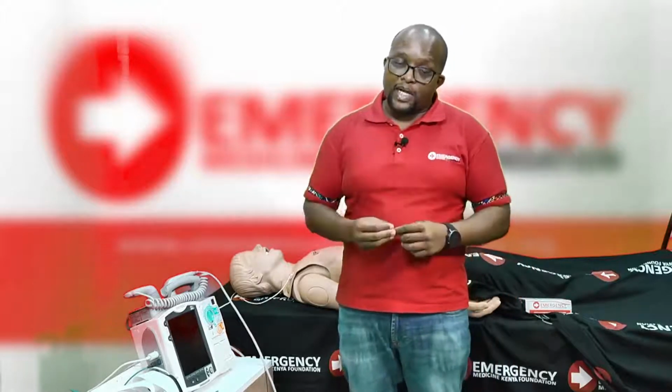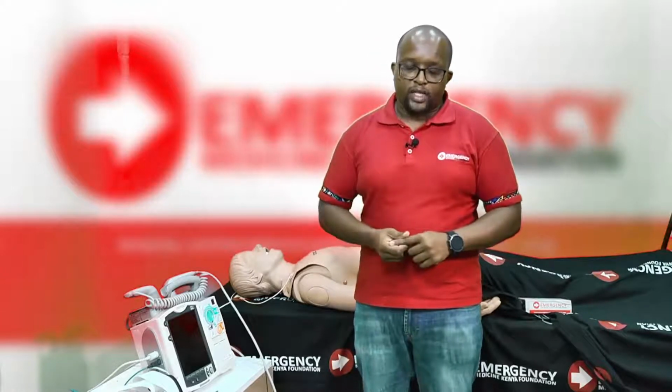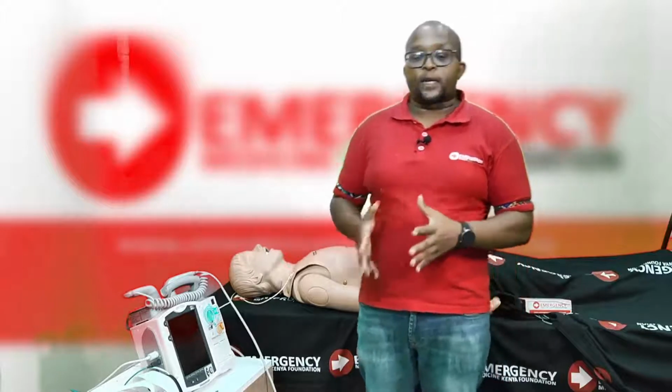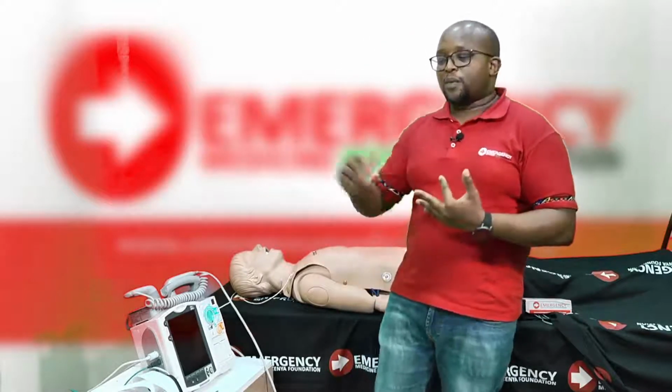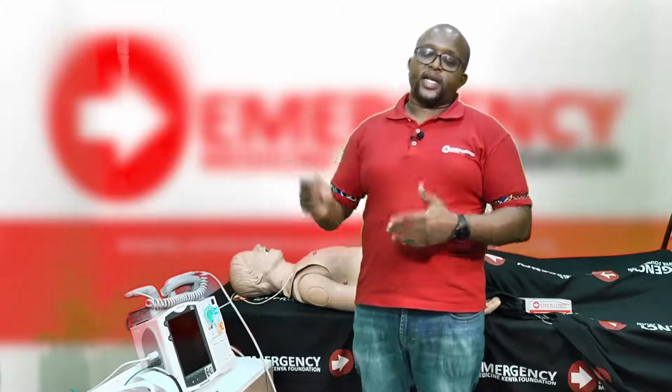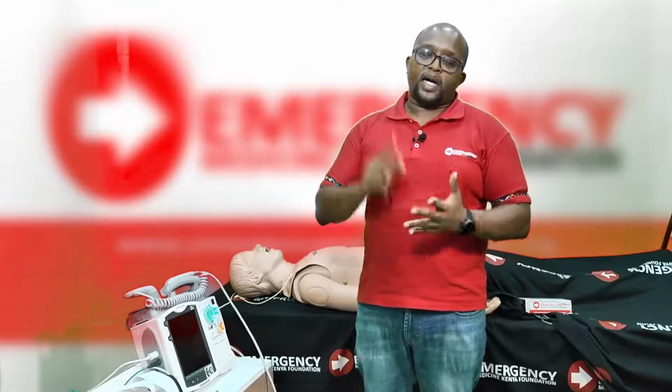You need to provide some analgesia, just initial dosages. You can always top up when they're back to normal heart rates. Some analgesia, some sedation to take the pain off, and of course tell the patient that you're going to do all this. And then the technique part of it is SMS, sync, confirm with their markers are on, okay, and then select energy joules. Normally you start probably at 100, and shock on expiration, all right? And if that doesn't work, go up on the energy joules by 50. Again, SMS, sync, markers, select energy, shock on expiration.